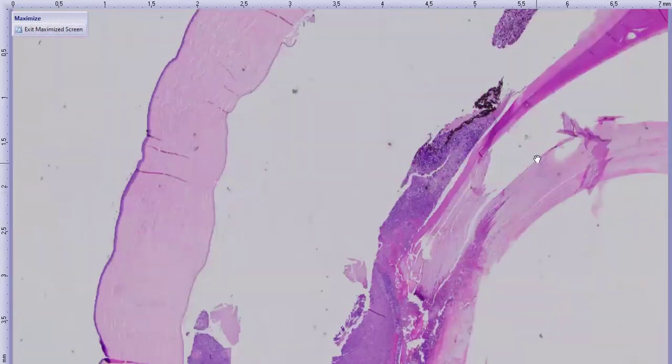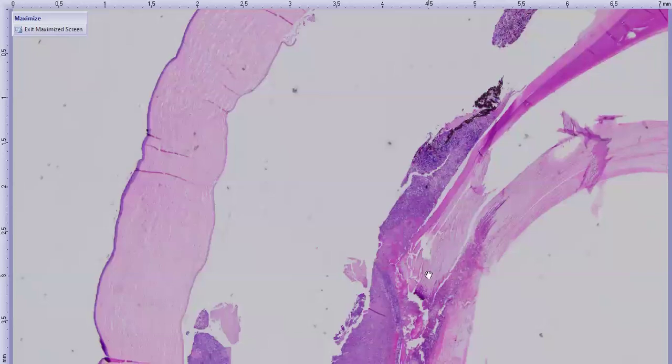Sectioning artifact, that is. But what we can see is here's this plume of increased cellularity, and the lens capsule, you can kind of follow it along here, is suddenly discontinuous here. And there's also a lot of basophilia and cellular material inside the lens.